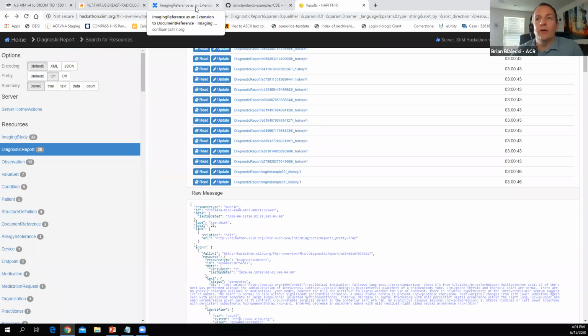This is where I can have an AI model that might be looking at imaging studies in advance, could have a particular observation and get this back in front of the radiologist. So I can say, look at this particular slice, I believe this is a pneumothorax, and it would come back.